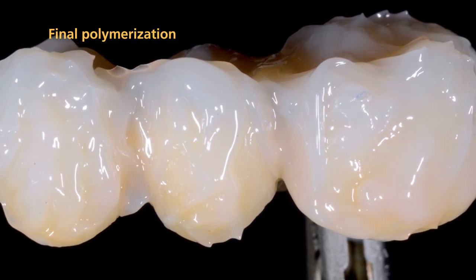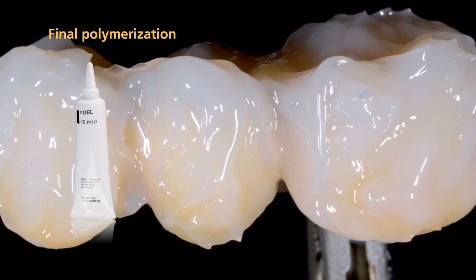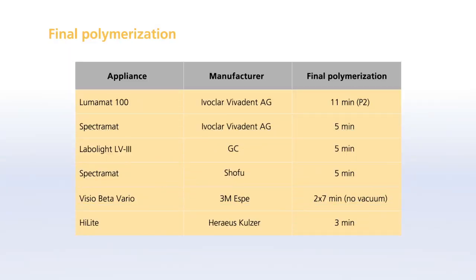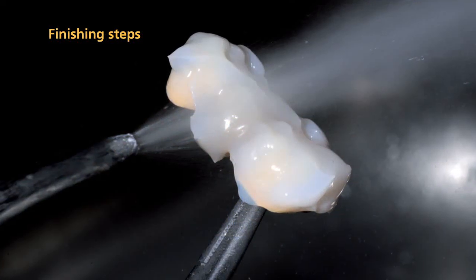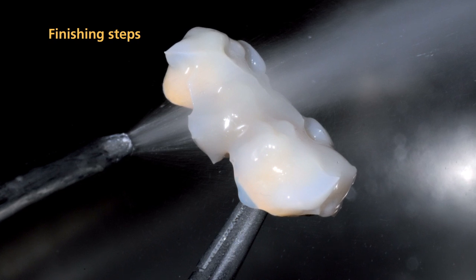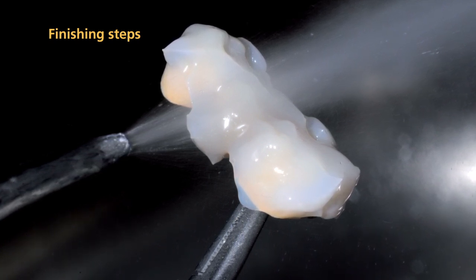Before you conduct the final polymerization step in the Lumamat light furnace, apply SR-Gel to the NEXCO surface. Make sure that all areas are covered and the layer is not too thick. Please observe the polymerization parameters specified in the SR-NEXCO instructions for use. After you have completed the polymerization procedure, completely remove SR-Gel from the restoration using running water or a steamer.